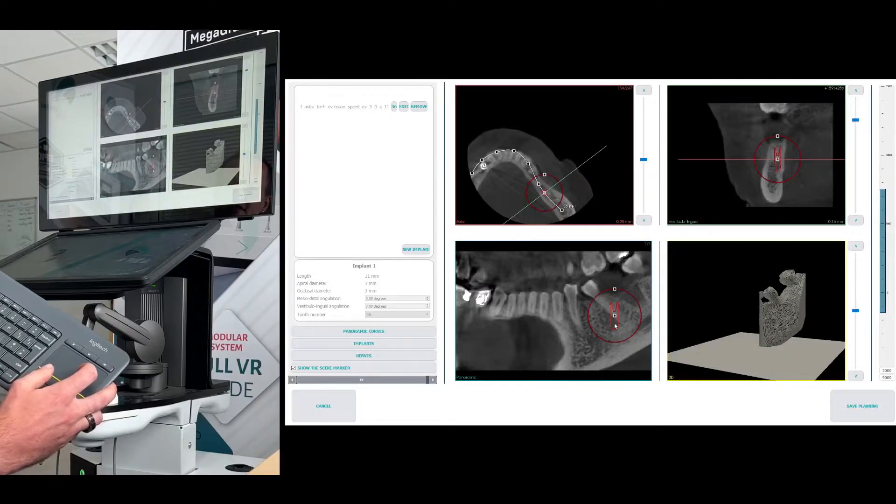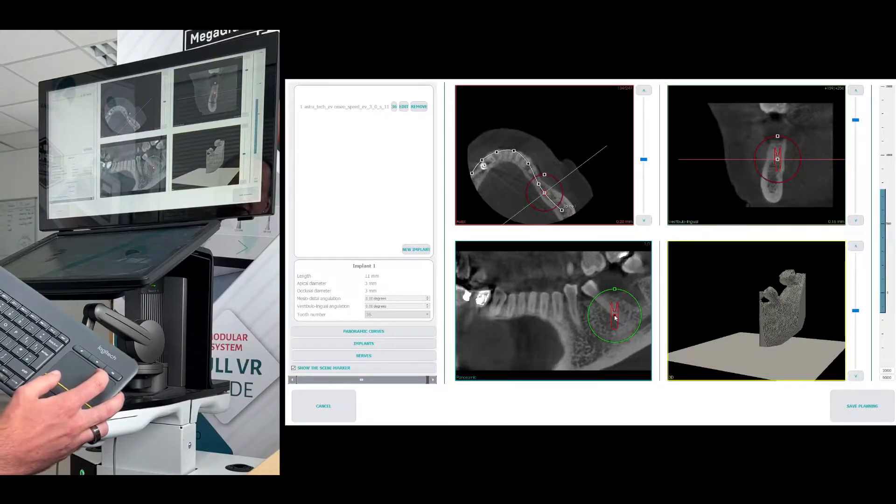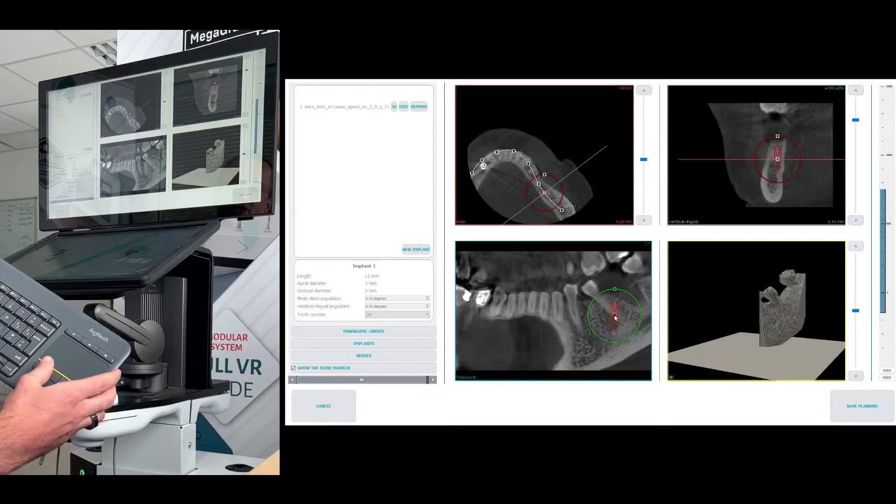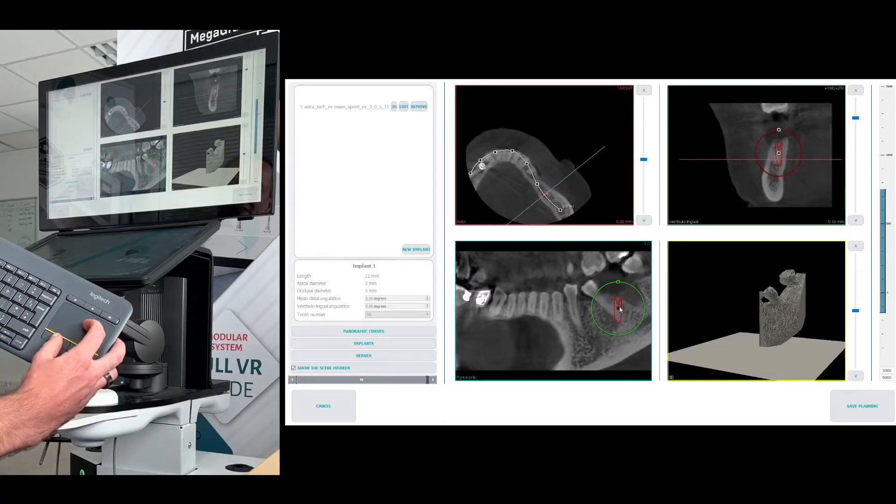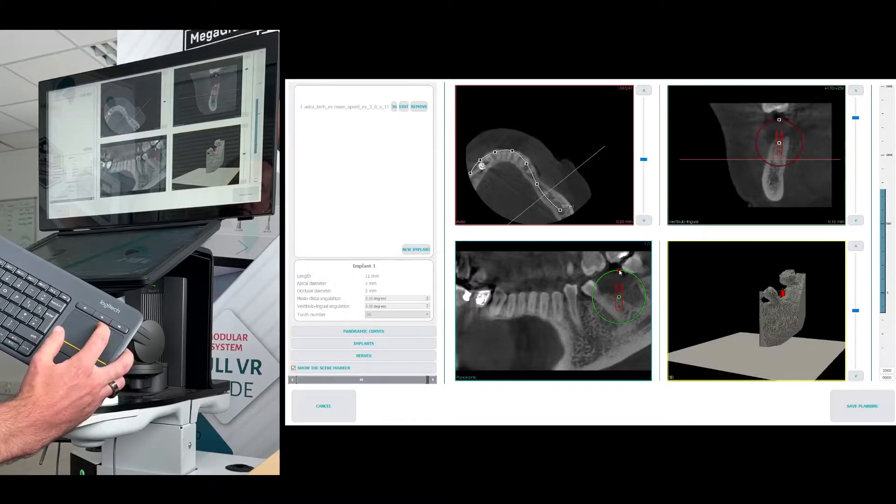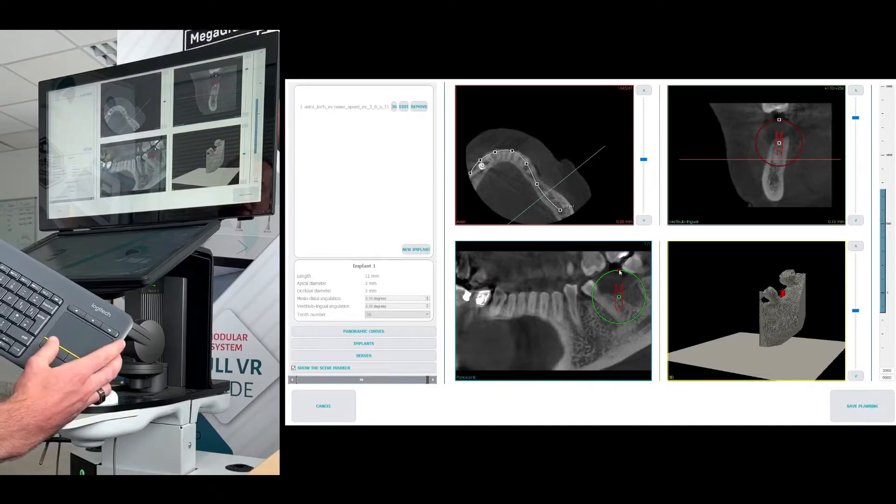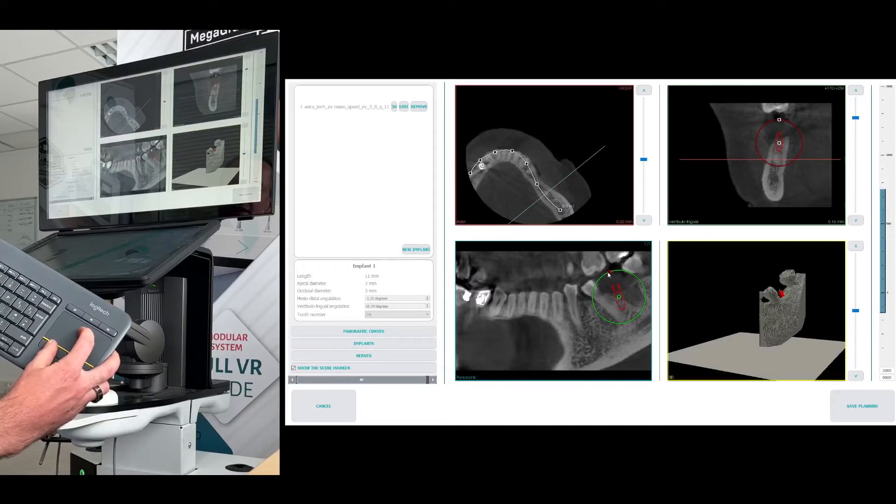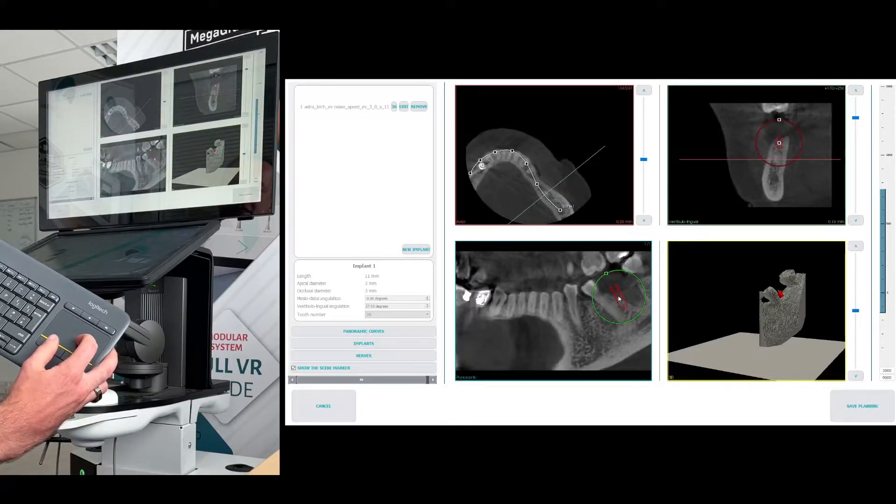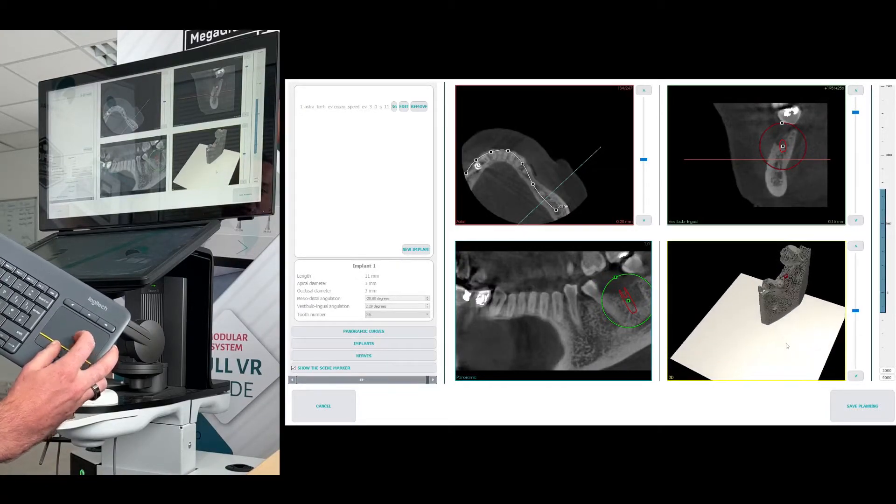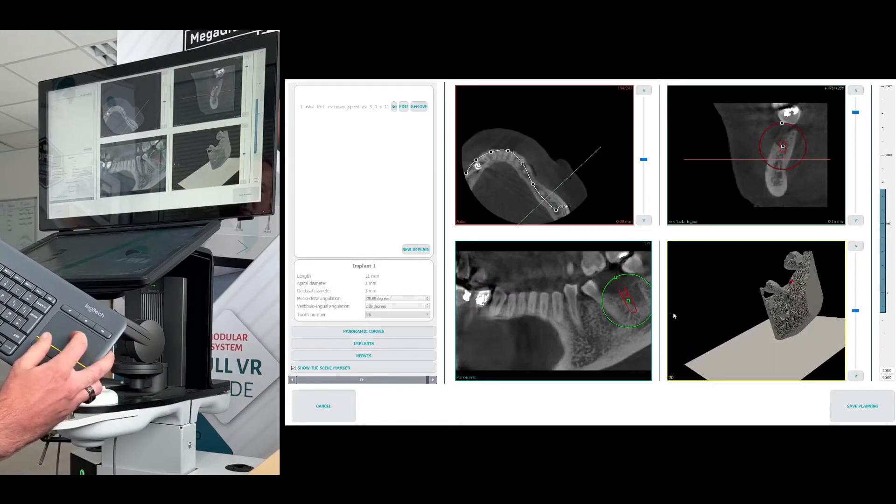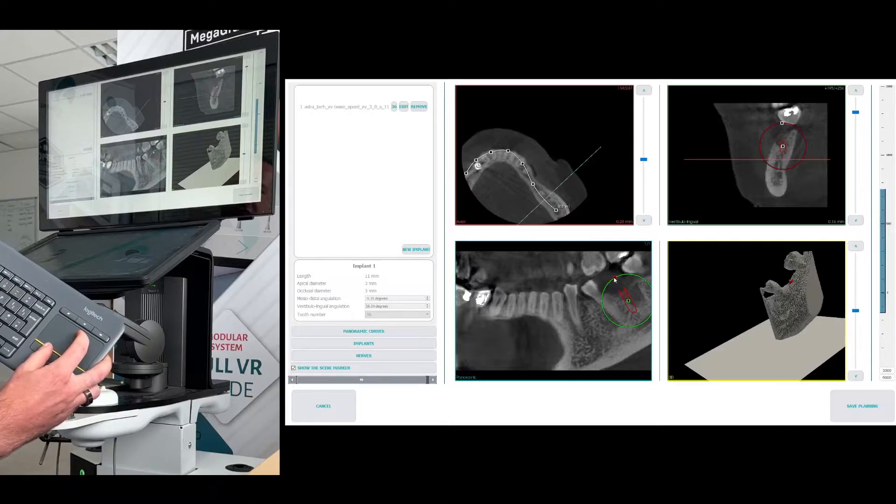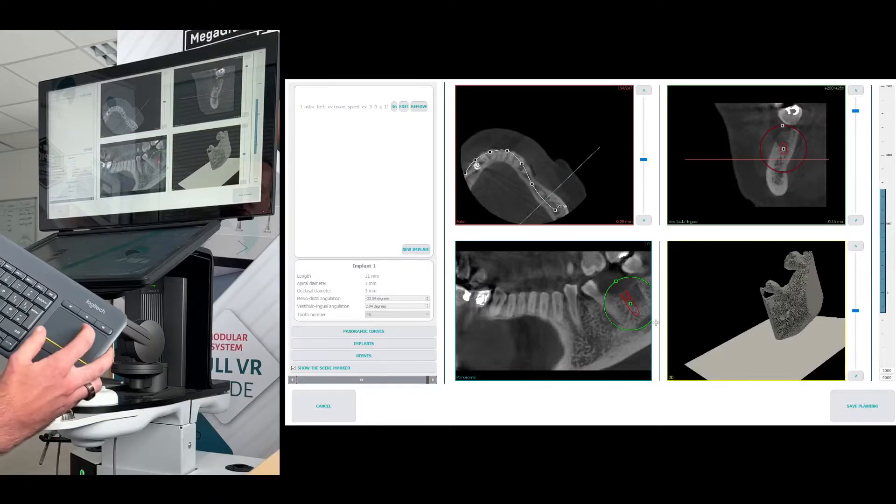You see there in the panoramic view, this is the easiest place to move it to start with. And if you go to the center of the implant, the square goes red and the circle goes green. Click left click and drag to change its placement. If you move up to the small square on top as that goes red and the circle again green, click and do a manipulation to rotate it. We can see there on the 3D view a visualization of where that implant is going to be. So that looks fairly central and in between the two teeth. Perhaps my rotation needs to be slightly more and then I'll just bring it in to the jaw.